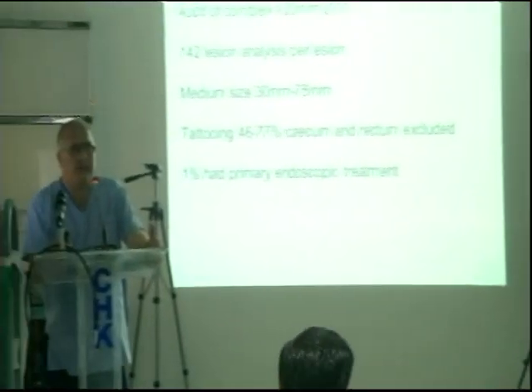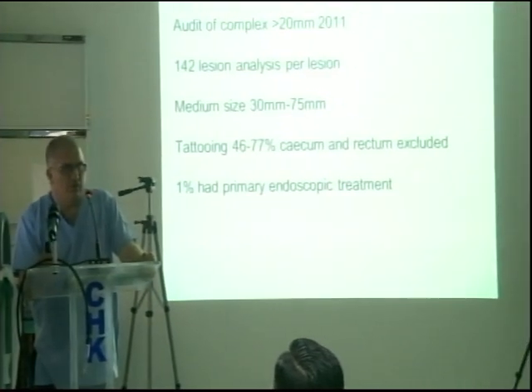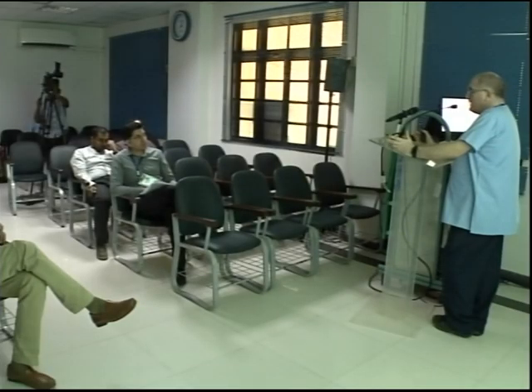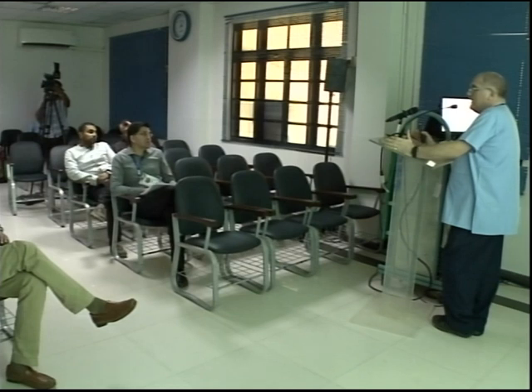So your injector needle, how much does it hold? How much does your injector needle hold? The dead space. What is the dead space of an injector needle? So you prime it with, how much does it hold? How much does it take to prime a needle? So I've always asked you not to guess. Best thing is always, because the needle may vary, so always do it in front of your eyes. So it is, the majority is 1 mil, right?